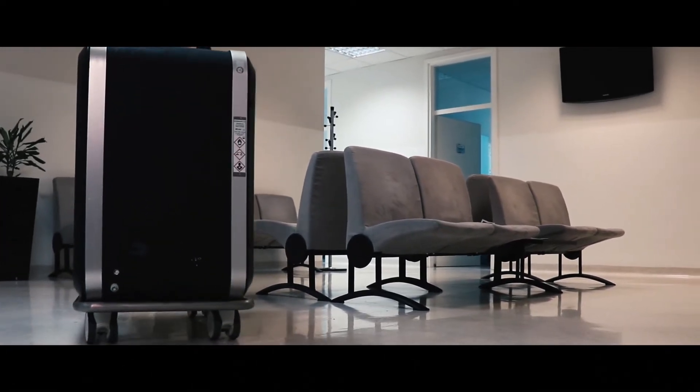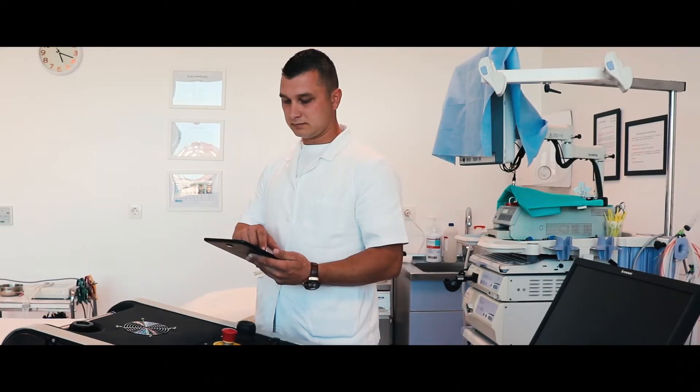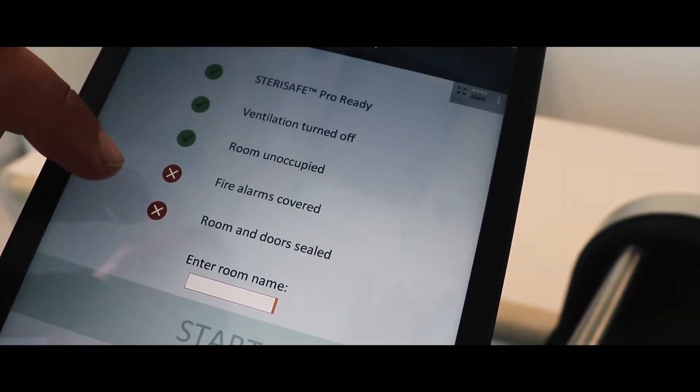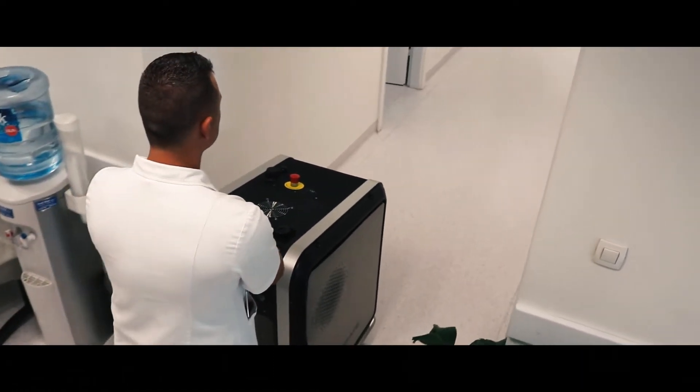A wireless tablet monitors the entire disinfection process and informs you when the disinfection cycle is complete. In addition, the Sterisafe Pro requires no chemical additives and consumes only water and electricity. No more expensive hydrogen peroxide cartridges or UV bulbs.